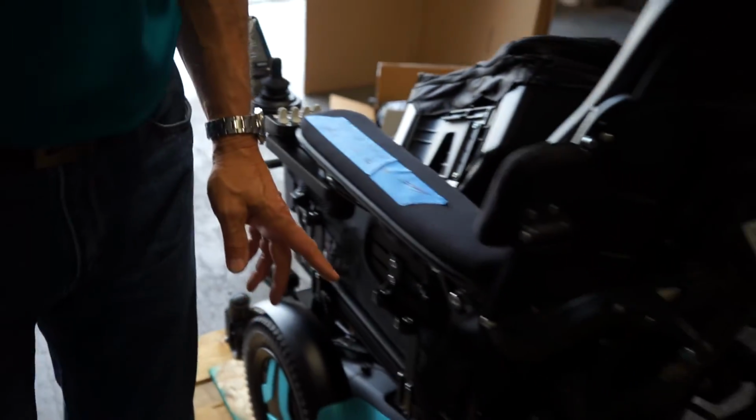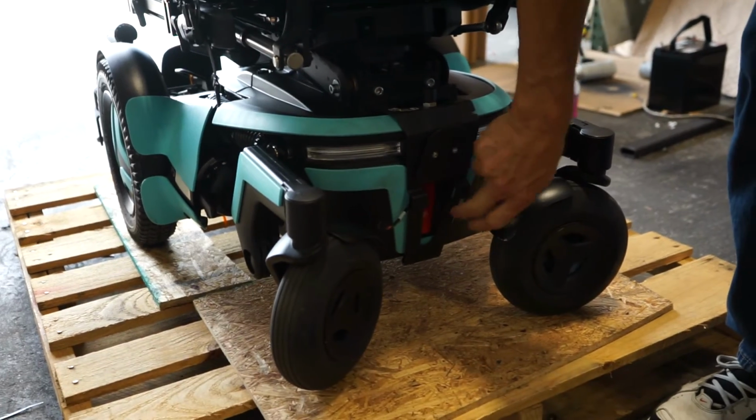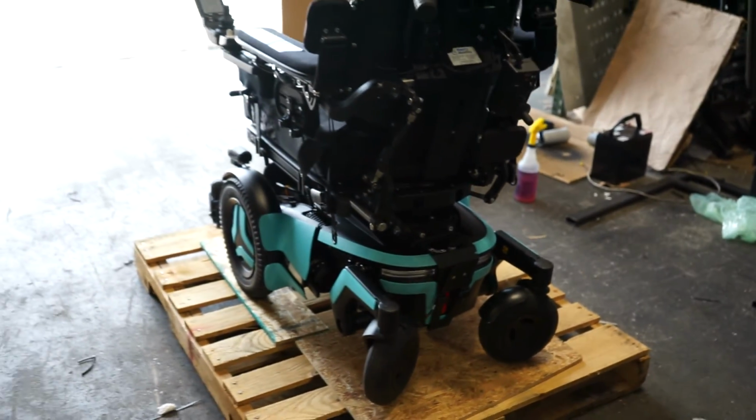When you first get your chair, you're going to come back here, right under here, where the red reflector goes. There's a button in there, turn the power on, right inside of here, okay? All right, hopefully you'll enjoy the chair.